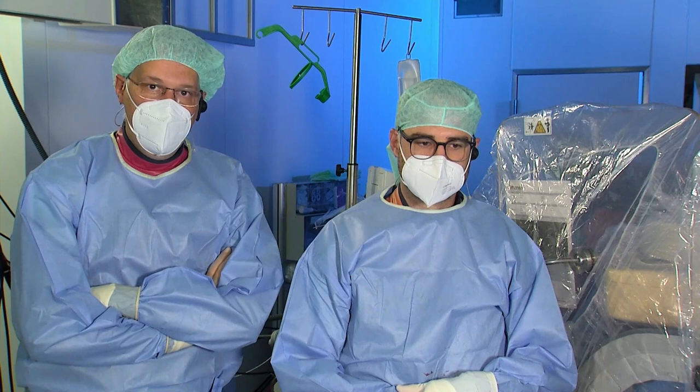Welcome to the hybrid OR in the St. Johannes Hospital in Dortmund in Germany. We are here today to implant a Navitor valve in an 82-year-old patient. We would like to highlight some special aspects on how to minimize the risk of conduction disturbances during our procedure.